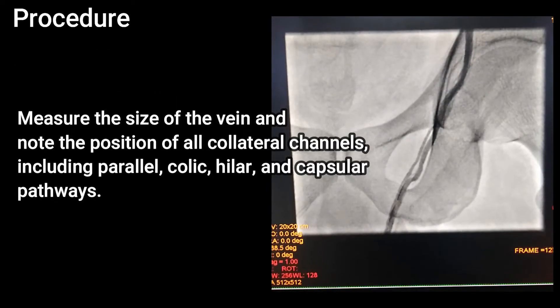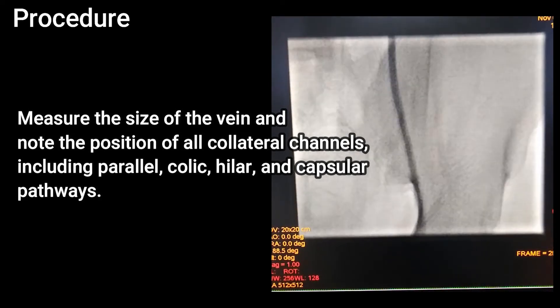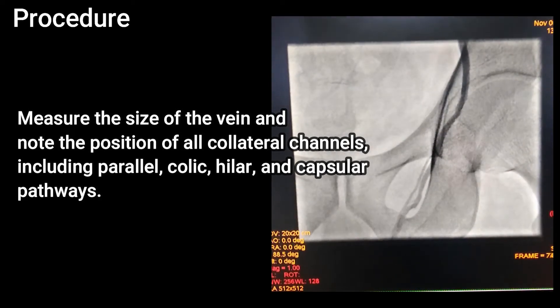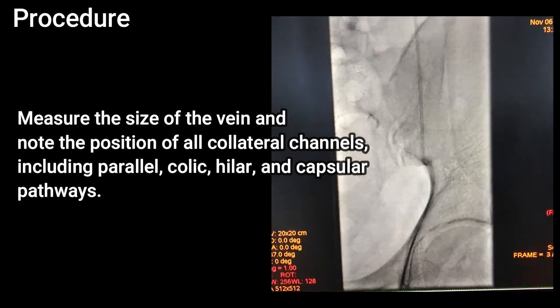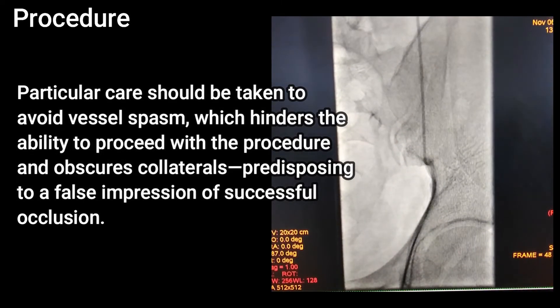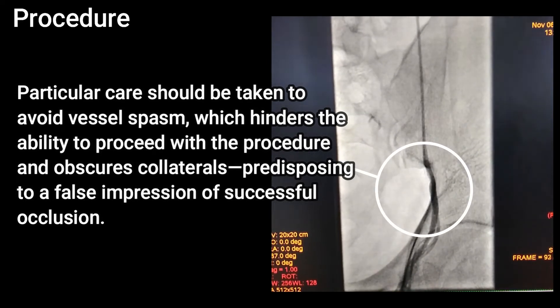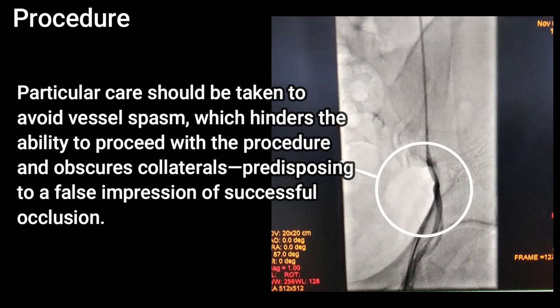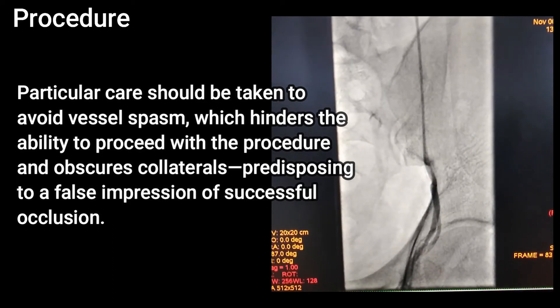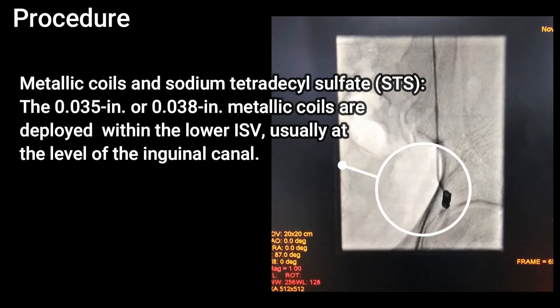After that, we measure the size of the vein and note the position of all collateral channels, including parallel, colic, hilar, and capsular pathways. Particular care should be taken to avoid vessel spasm, which hinders the ability to proceed with the procedure and obscures collaterals, predisposing to a false impression of successful occlusion.